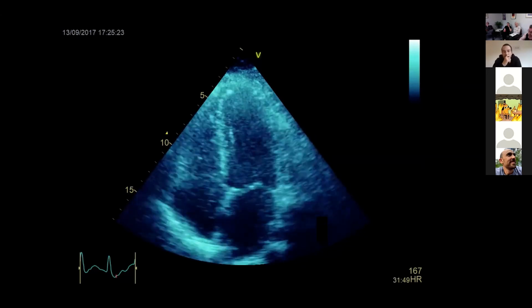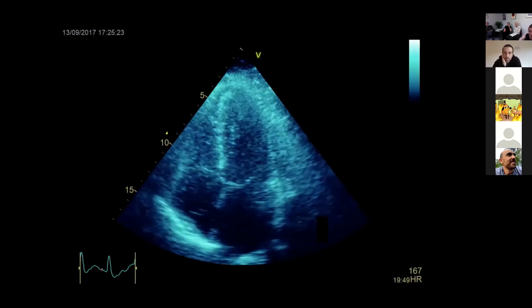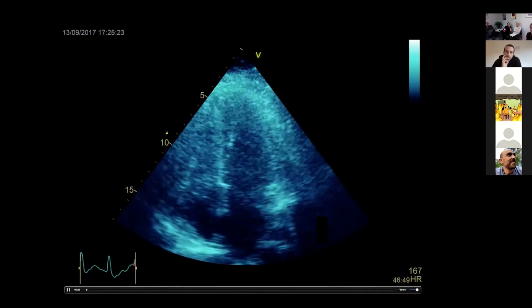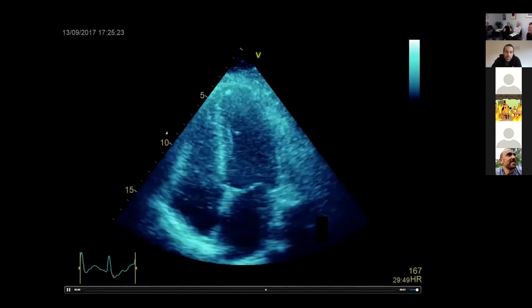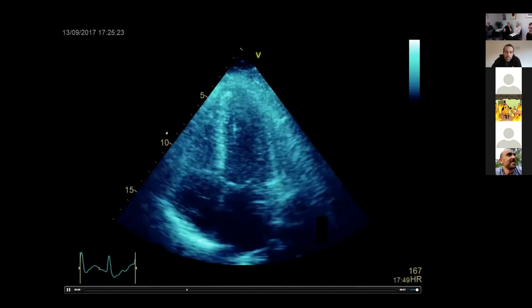Well, I think it was someone who's looking like they're going at the clappers and the heart doesn't look like it's filling properly. I understand what you mean. Something doesn't look quite right. But again, it's the idea of seeing the whole heart. Don't forget all the information that you got down there. What did Prof say at the beginning was one of the most common things? Rhythm, right? The rapidity of that it came on.